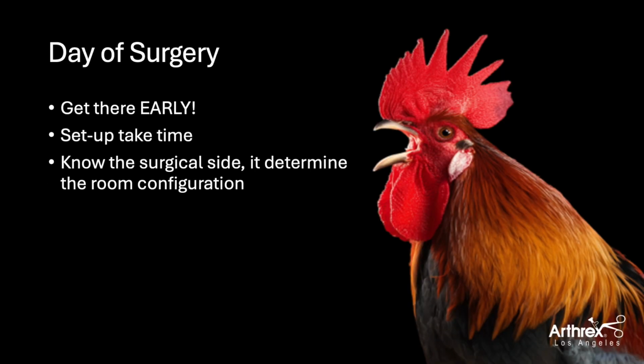All right, so the day of surgery, if it's a 7:30 case, I try to get there at 6:45 due to the fact that we have to set up a lot more than your standard arthroscopy case or fracture case, in which the room is set up by the time you get there. For spine endoscopy, the first thing is to make sure that we identify which room is going to be in the setup, because we want to make sure whether it's a right or a left side pathology.